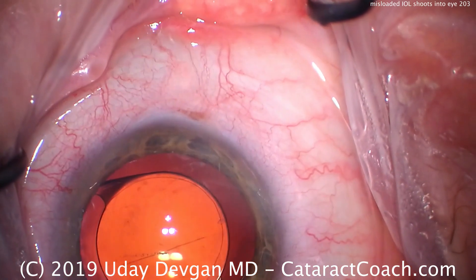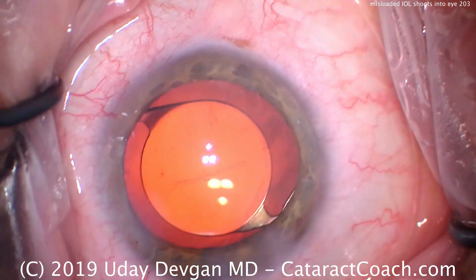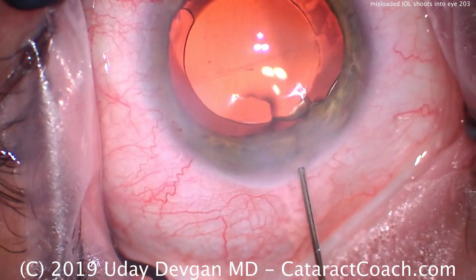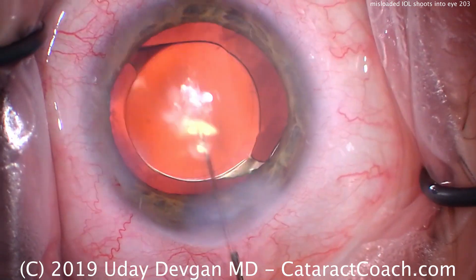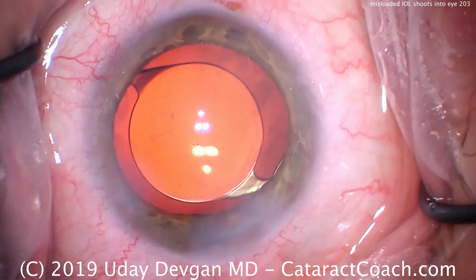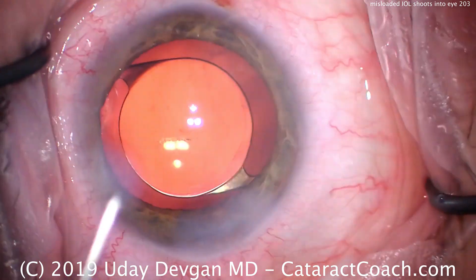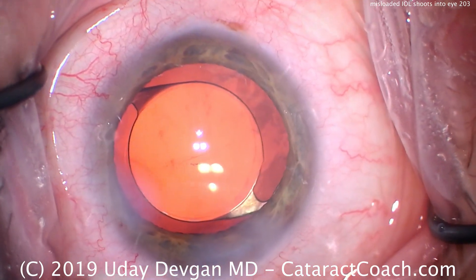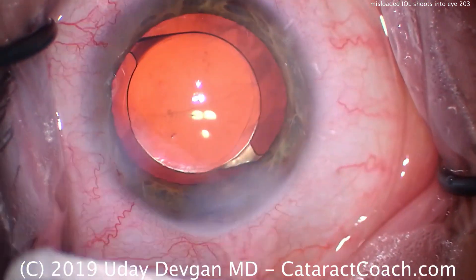So very important: make sure that all your team members, especially your technicians, are on board and understand how to load the lens appropriately per the manufacturer's recommendations. And also for the surgeons, be sure that you can react in time. You never know what's going to happen during surgery, and you have to be able to appropriately react to get the lens in the eye safely, even if it shoots out of the injector in a relatively fast and uncontrolled manner.